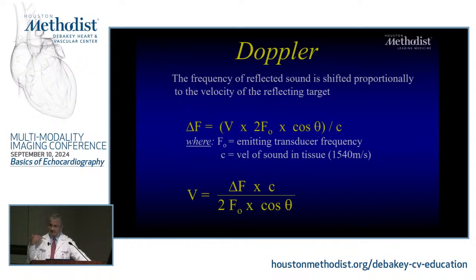In the old days, early days of Doppler, the y-axis of what you see nowadays as velocity used to be frequency shift. It used to be in kilohertz. And then you had to do mathematical things, but computers were invented for such. So the velocity is there, which means that the implication solving this equation is that theta is either 0 or 180. No adjustment for angulation.